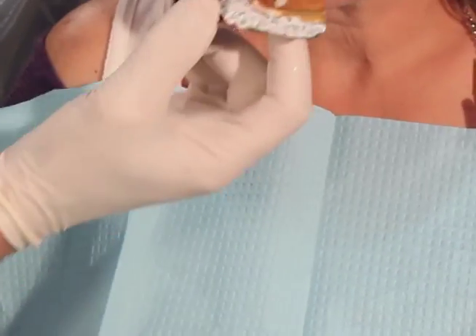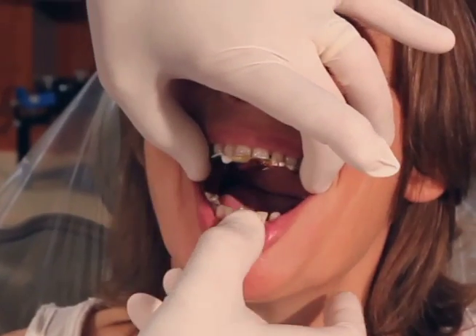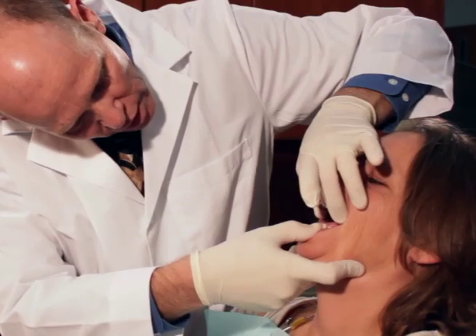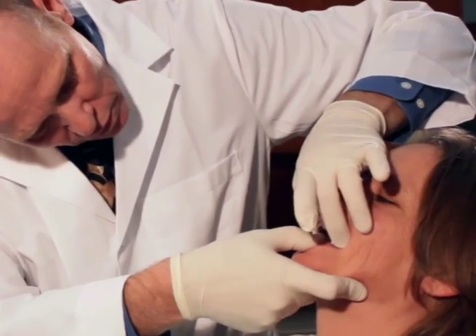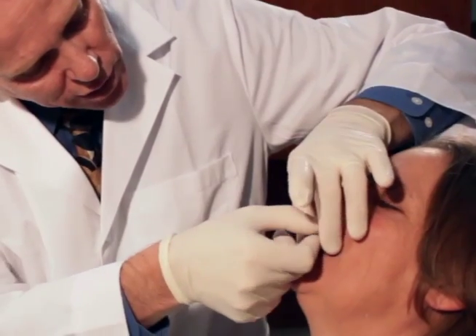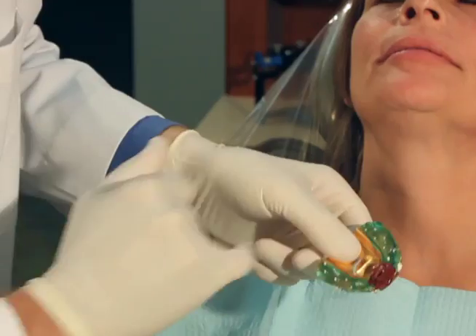Then we're going to come back into the patient's mouth. I'm going to hold this against the upper teeth while I roll the lower lip back, push back on the chin, have them slowly close, slowly close, and open. We're going to open all the way and remove the tray. We can see we have an index of the lower teeth here in the compound.